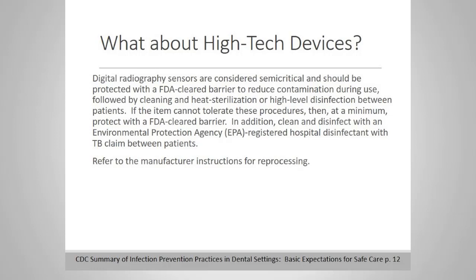So with high-tech devices, until our instrument processing catches up with technology, this is the best we've got to offer. I encourage all of you to refer to the manufacturer's instructions for reprocessing, because specific instructions should be provided for you. And at a minimum, use an FDA-cleared barrier, and clean and disinfect between use.